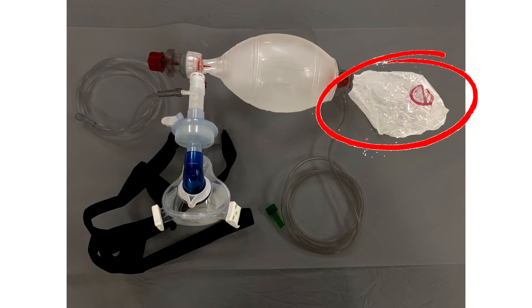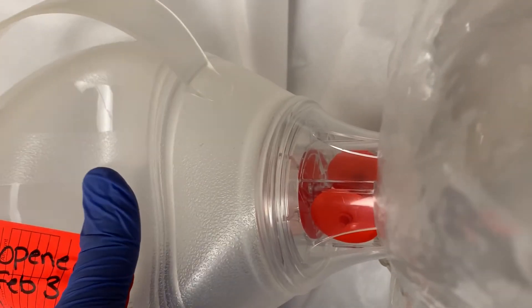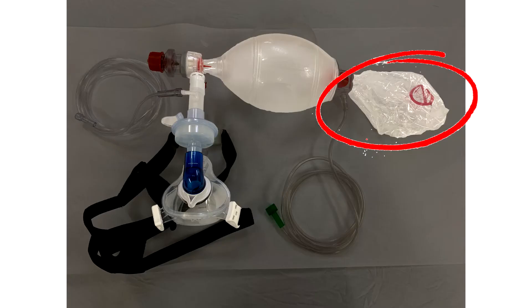When your patient inhales, they're accessing the 100% FiO2 in the reservoir bag. Your patient needs to be awake enough to create enough negative pressure to overcome these two valves. You should see very slight fluctuation in the reservoir bag. If they're not strong enough to activate these valves, you'll know pretty quickly because they won't be able to breathe.